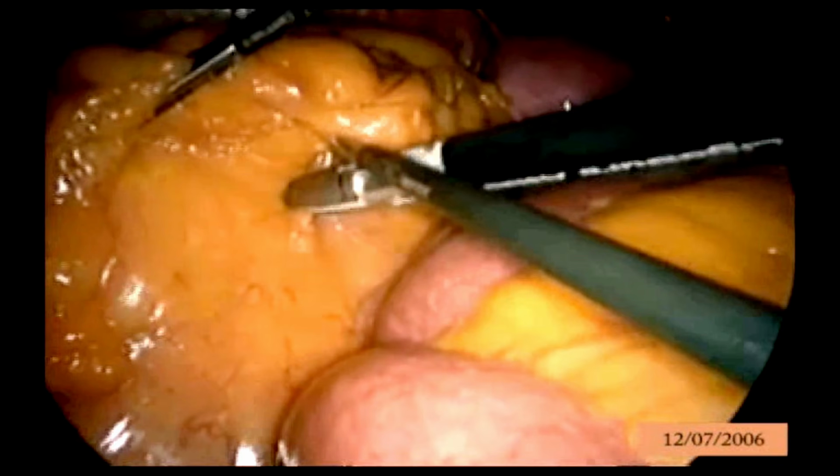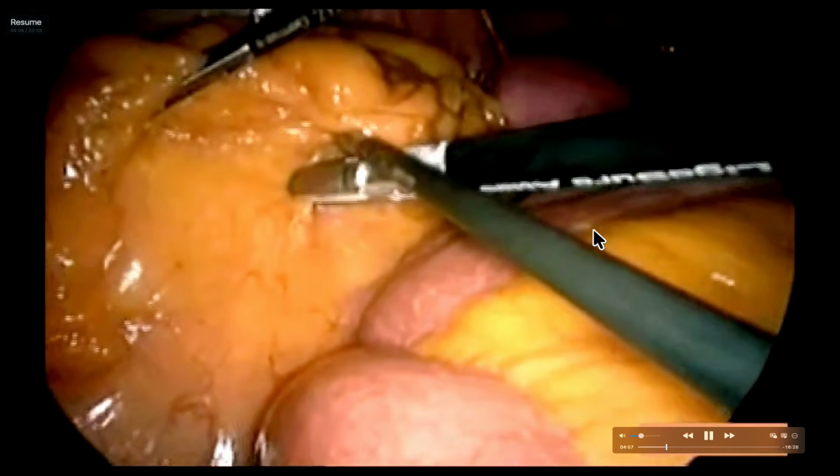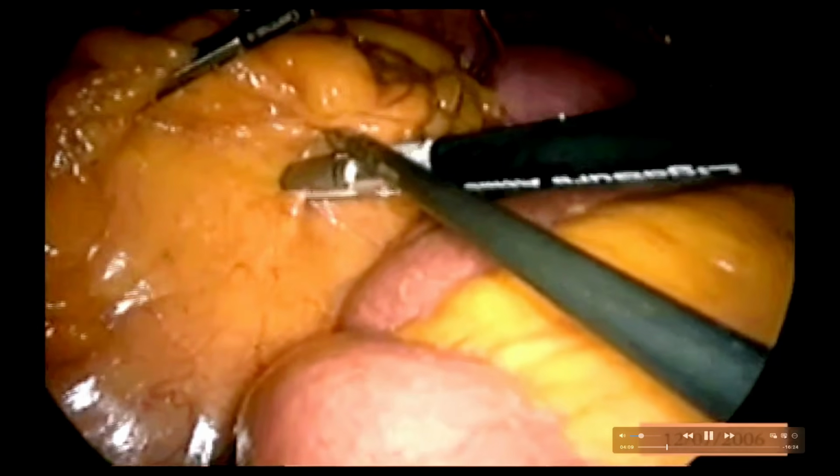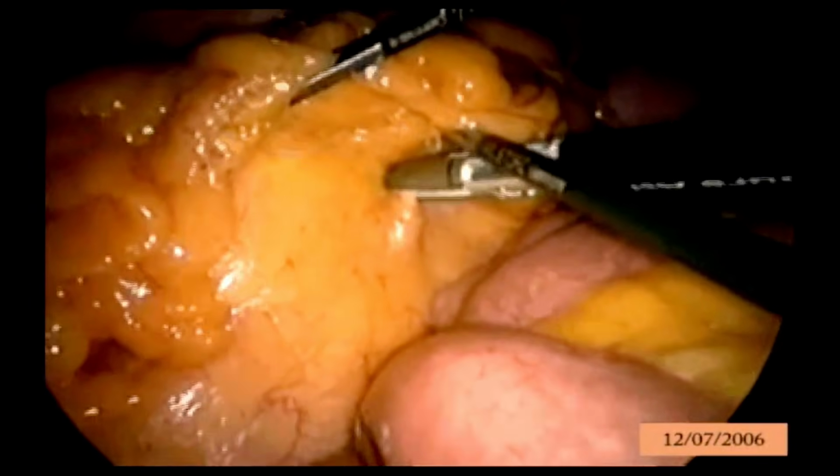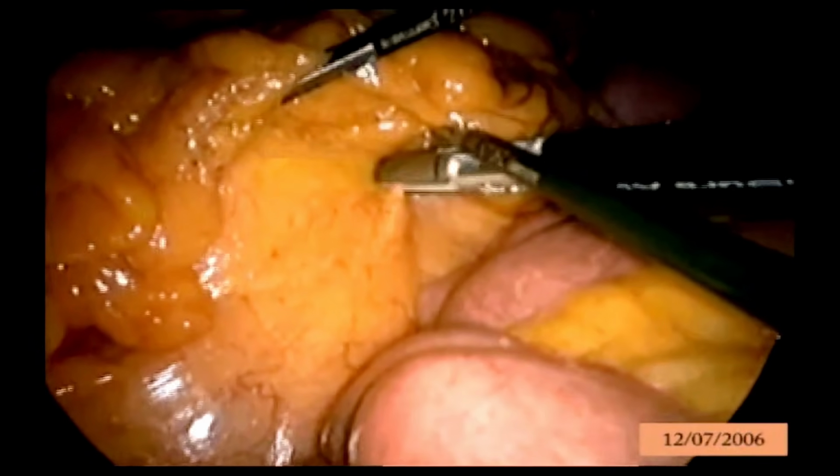LigaSure Atlas generator is the same, but this hand instrument is 10 mm. An advantage of Atlas is that up to 7 mm of vessel you can coagulate. Even the splenic artery and renal artery can be coagulated with LigaSure Atlas. So this LigaSure Atlas is coagulating the mesosigmoid directly.